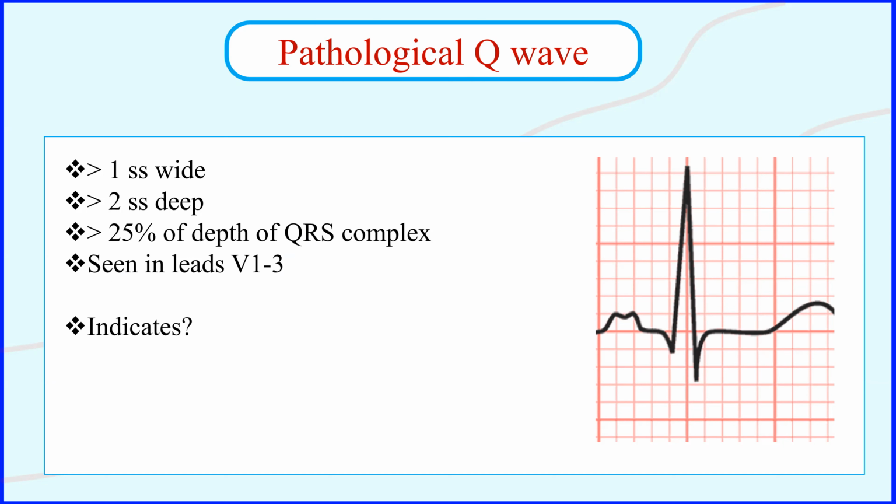And actually, you can differentiate between them. If the patient is currently having MI, usually there is ST segment elevation as well. But if the patient has a previous MI, the ST segment will be normal, and you will see only the Q waves. So Q waves always mean infarction. If you want to look for infarction, go and look for the Q waves.